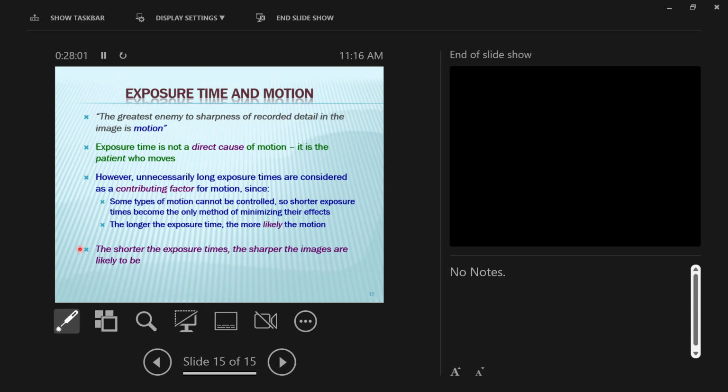You ever notice like when you take images in the nighttime or in the dark, it takes longer to make the exposures, right? It's because there's less light, so you take longer for the light to come in, and the thing that you're taking the image of might move around, right? In the bright daylight, you can take very clear images even when things are moving fast. Because there's a lot of light coming into the camera, the information's there, so we can use a shorter exposure time. If you've done anything in photography, it will greatly help you in radiography. So, taking pictures will help you understand radiography for sure.